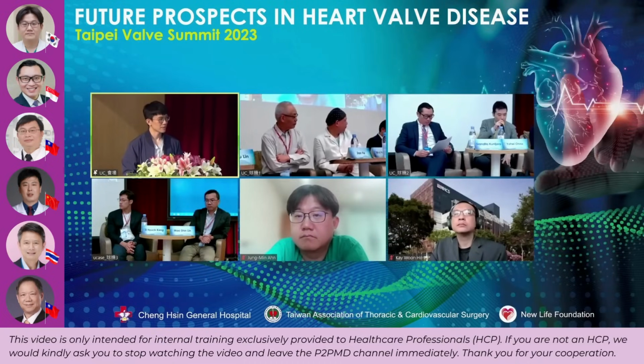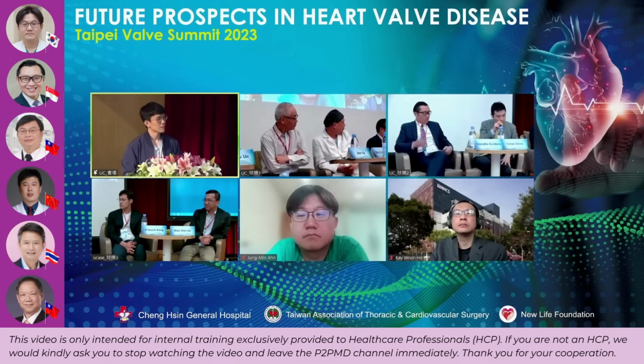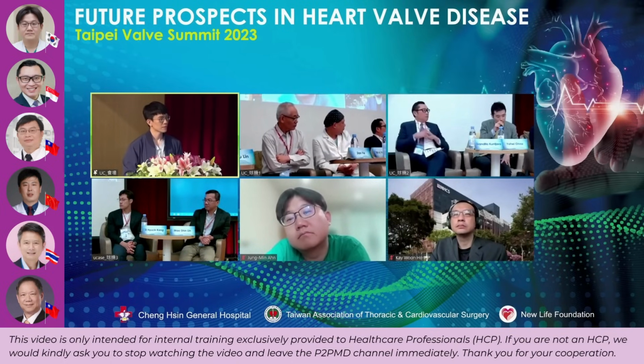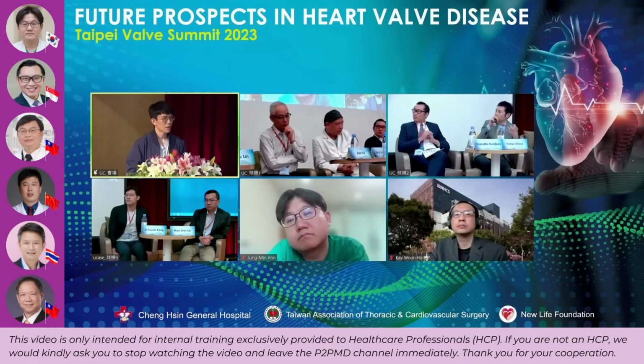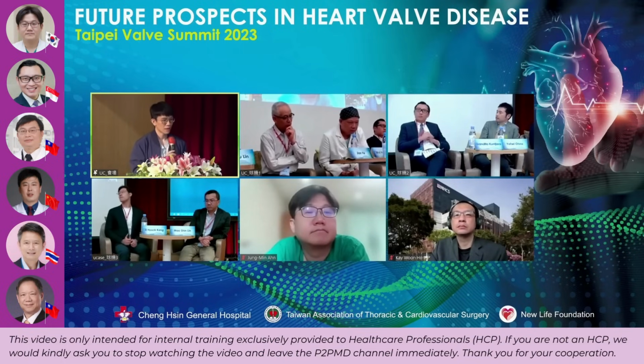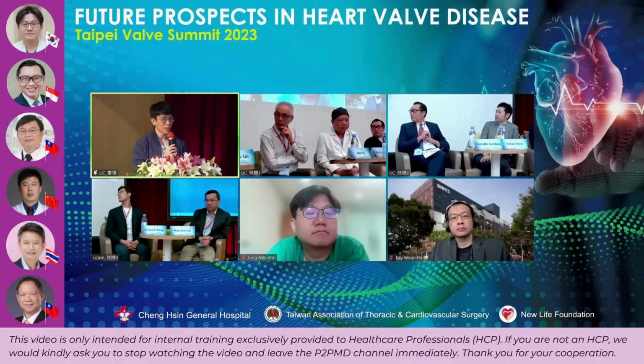So seven months after the index procedure, the patient developed heart failure. Based on your images, I recognize that the paravalvular leakage worsened over the months. Was there any recoil of this balloon expandable valve due to the very heavily calcified native valve? I think in this patient the valve was undersized, and maybe there was some recoil after valve deployment.